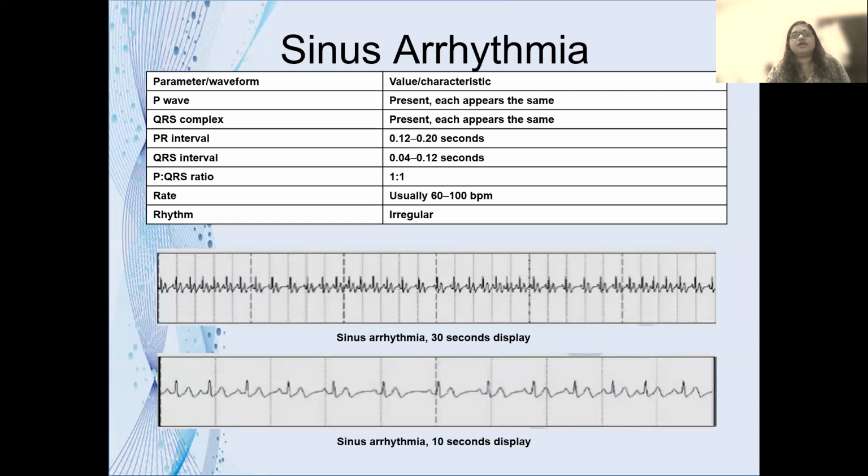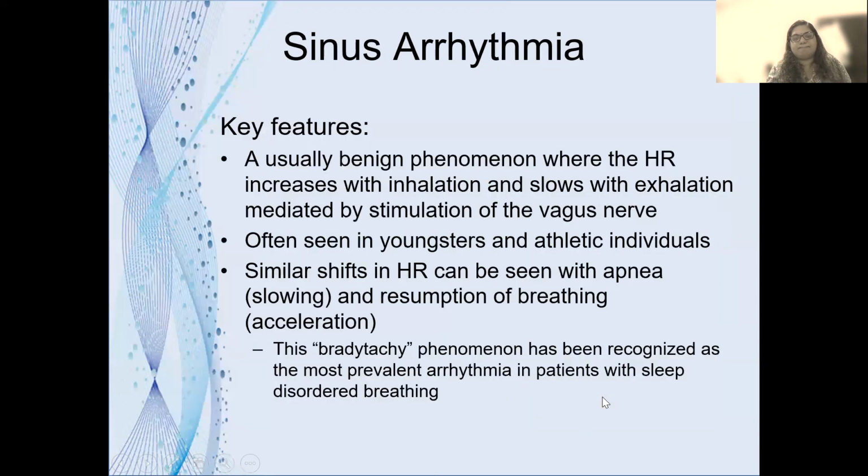Now, sinus arrhythmia, where you have irregular features in the rhythm. So you can see that the rhythm is irregular, but there can be a normal morphology. It is usually a benign phenomenon where the heart rate increases with inhalation and slows with exhalation. So this is sinus arrhythmia.